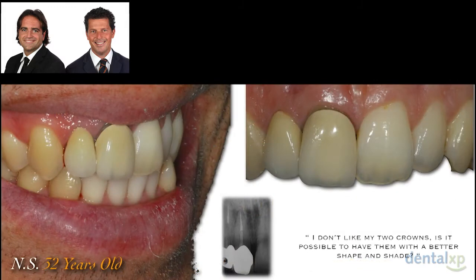And let's see a clinical example of how we can use and how we can try to close this fully digital circle. So let's take into consideration this 32-year-old patient, a friend of mine, who came to our office because he didn't like the shape and the shade of his crown. And of course, once again, a standardized protocol.